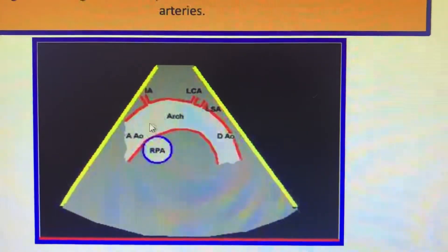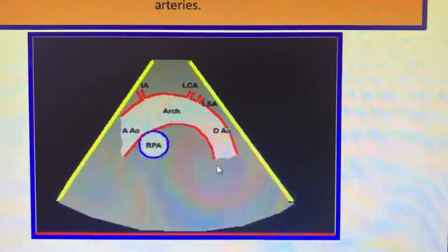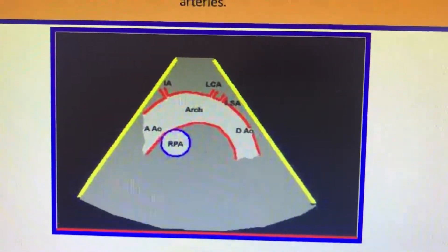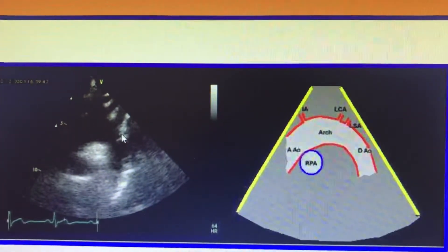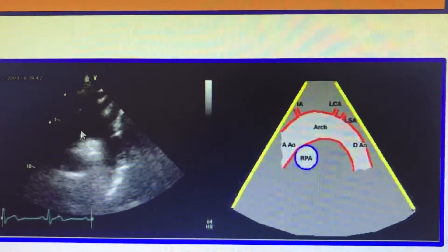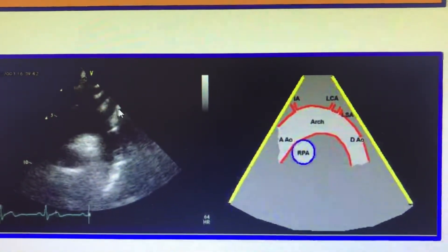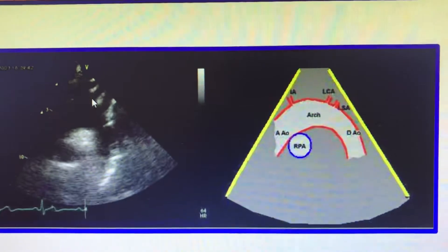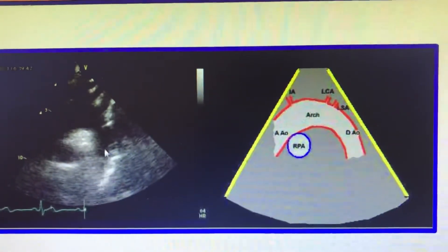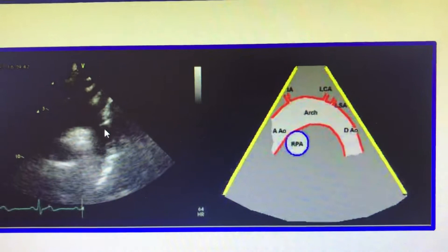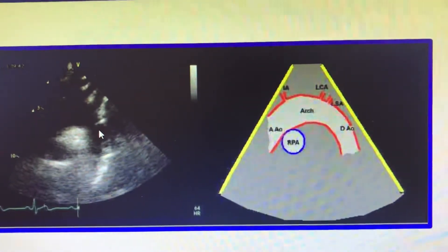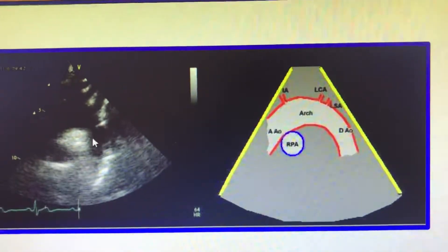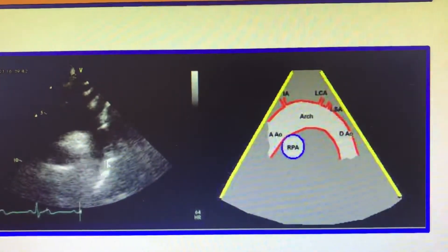What is very important in the suprasternal view is the arch and the descending aorta. You can see here beautifully the arch and descending aorta, the RPA, and the subclavian or innominate carotid arteries going away from the probe. We assess the descending aorta and arch because distal to the left subclavian artery is where we see coarctation of aorta and interrupted aorta.